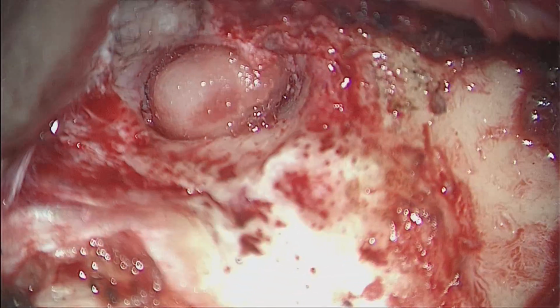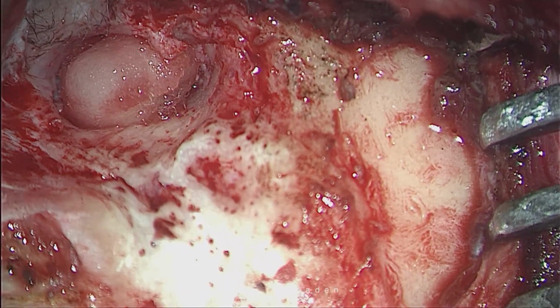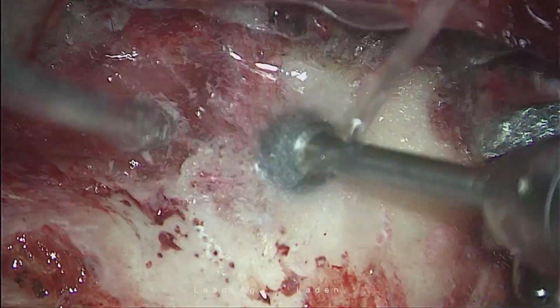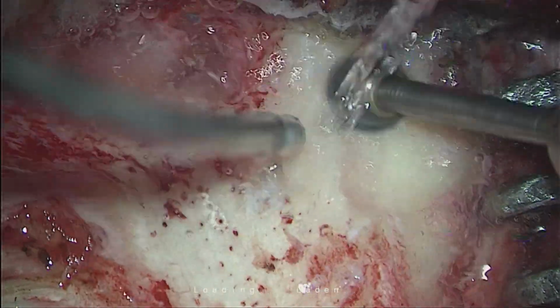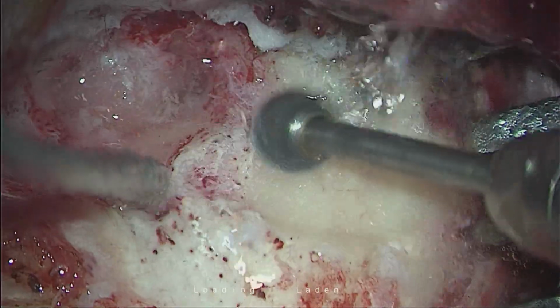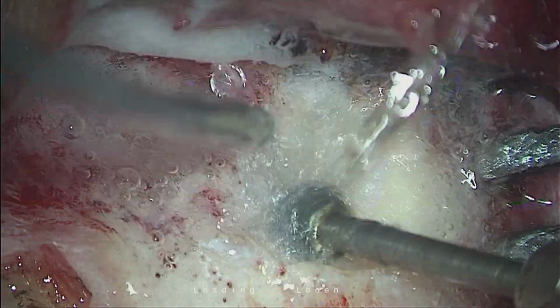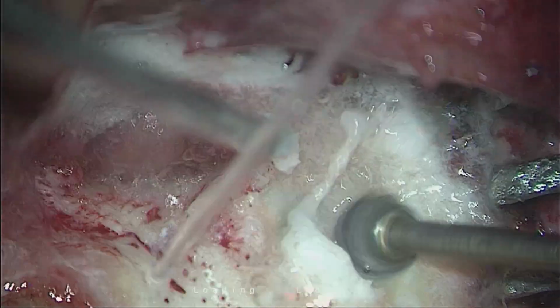So the best test we do is checking the patency of the mastoid air cells down the eustachian tube on the table. So this is a test, not a cortical mastoidectomy or anything I am doing. The moment I find the patency, I will stop. I am not doing a classical cortical mastoidectomy or antrostomy or anything. I am not doing antrostomy. My goal is not to open the antrum from here. My goal is to check the patency.